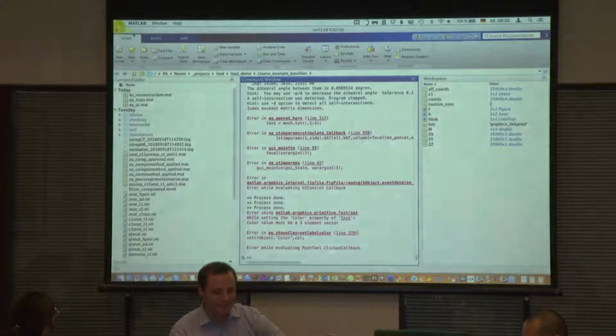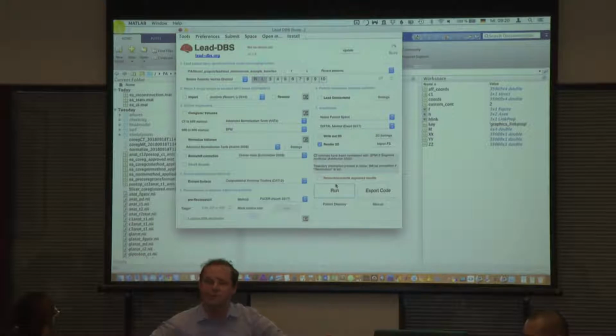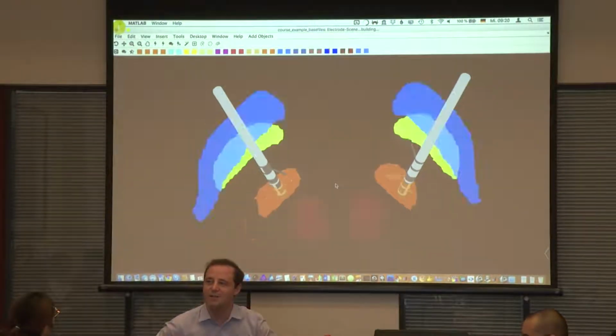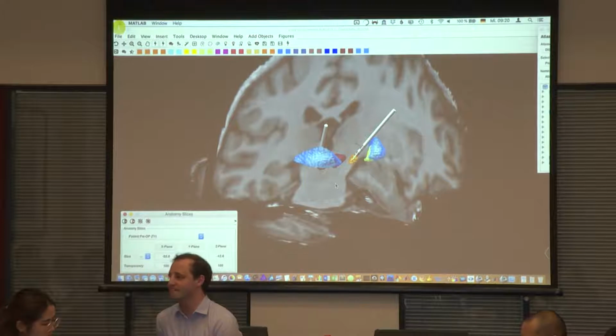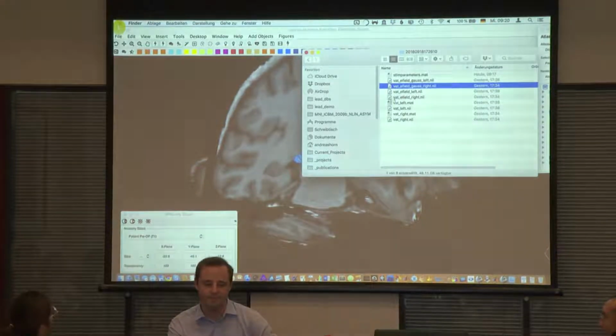Any questions? Okay, there was even an error. Any questions about this viewer? Do you have any thoughts about it or anything we could change? Yeah. If we want to run tractography in another software, so we will use the NIfTI, and which image should we use as our base space? The shell? The MNI template, I think.